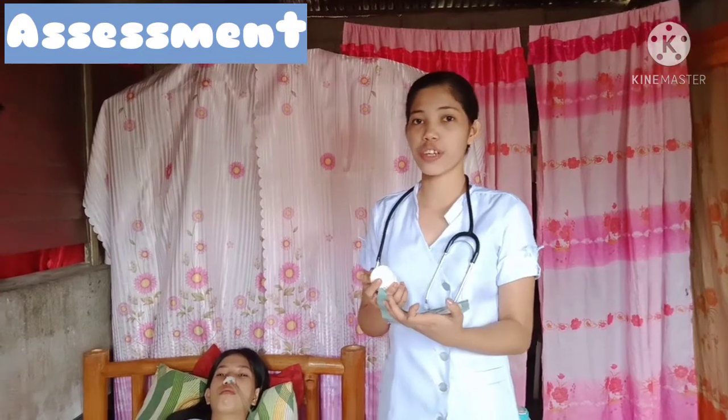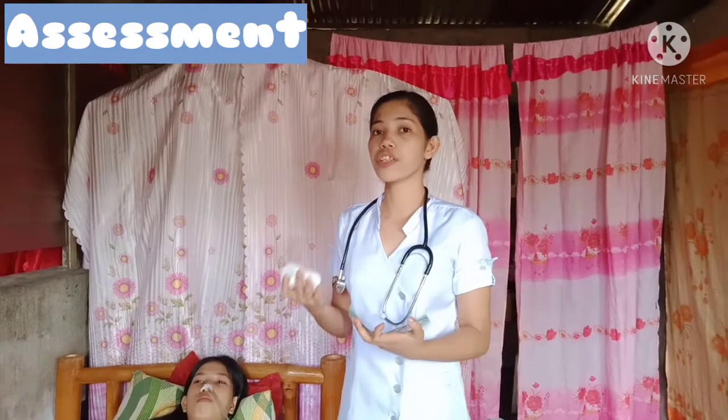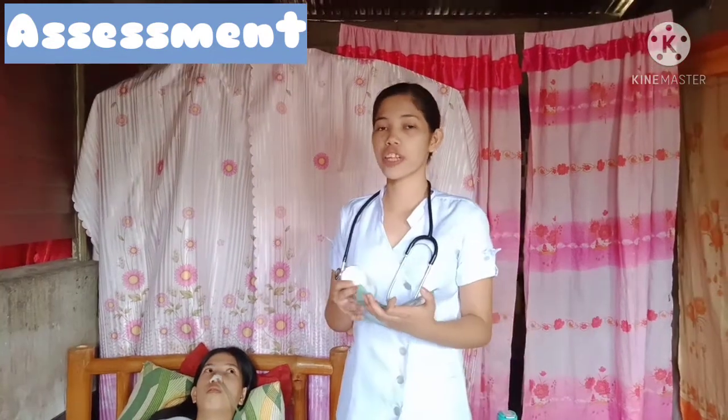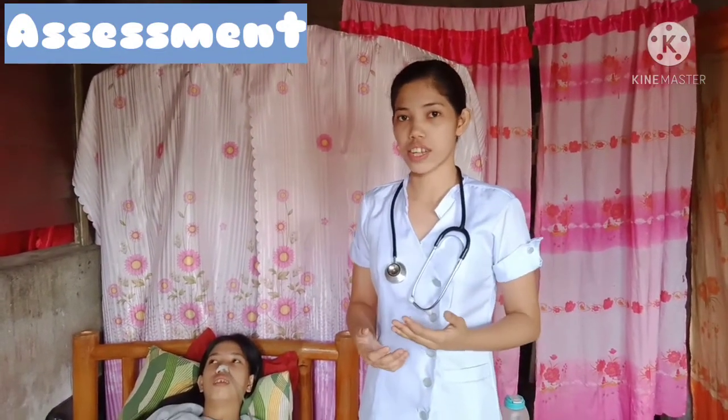Verify the physician's order for formula, rate, route, and frequency. Laboratory data and bedside assessments such as finger stick blood glucose measurements are also ordered by the physician, since tube feedings, laboratory tests, and bedside tests should be ordered by the physician.